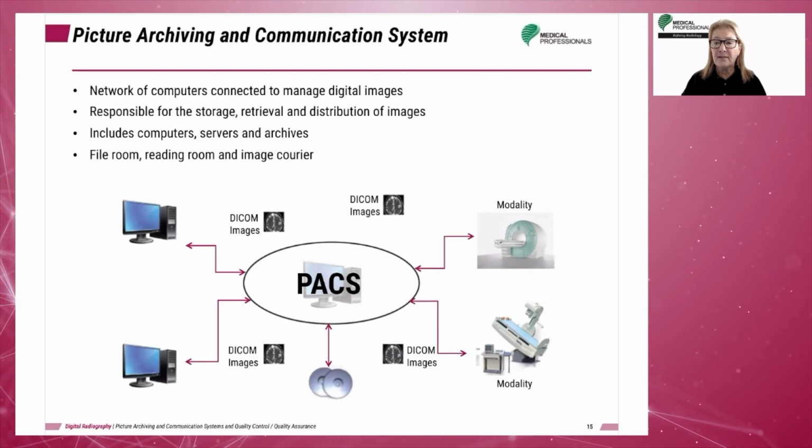In fact, the PACS has replaced the traditional X-ray file room, the radiology reading room, and the delivery services previously utilized to distribute images. Multiple users are able to access images simultaneously from various locations, including different cities, states, and countries.